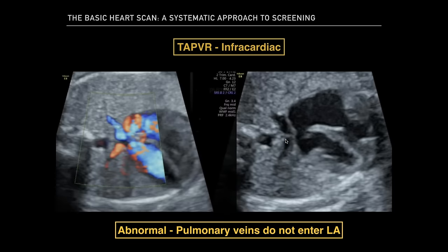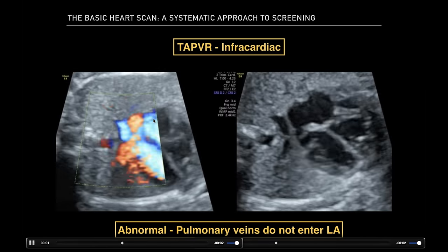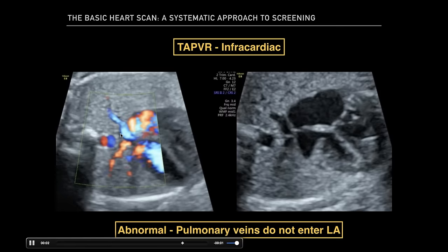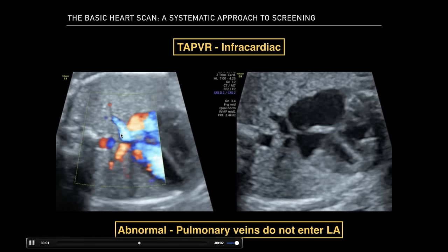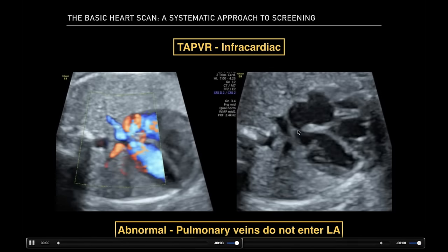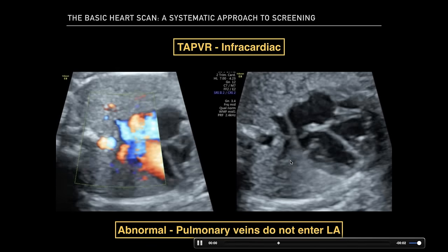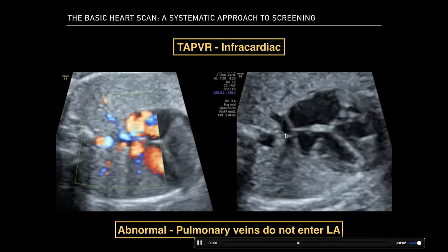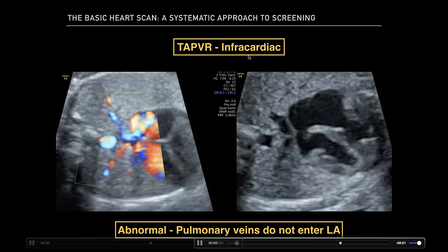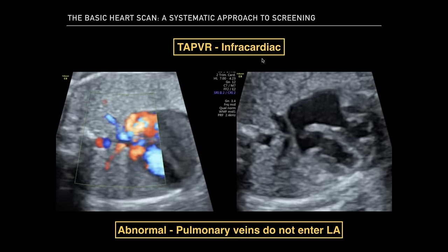That's something to keep in mind when taking a look at the pulmonary veins. Applying color Doppler, you can see what may appear like true pulmonary veins draining into the left atrium and can get interpreted as normal, most especially if color settings are not optimal. In this case, identifying the pulmonary veins in grayscale and making sure you see the slit-like openings into the posterior wall of the left atrium was key in identifying this abnormality. And of course, this ended up being a total anomalous pulmonary venous return.